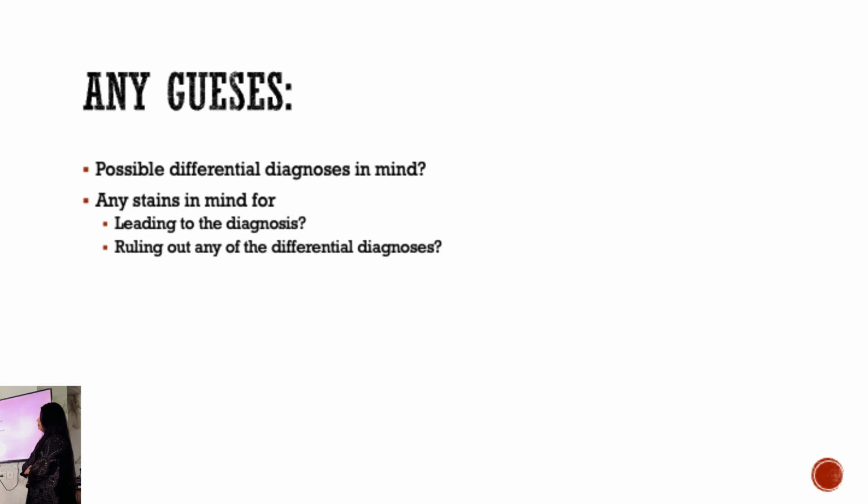Good thought. Melanoma, very good. Melanoma is a good differential. So you can think of melanoma based on the pigment-containing population we have here. Now, any differentials in the small round blue cell population?